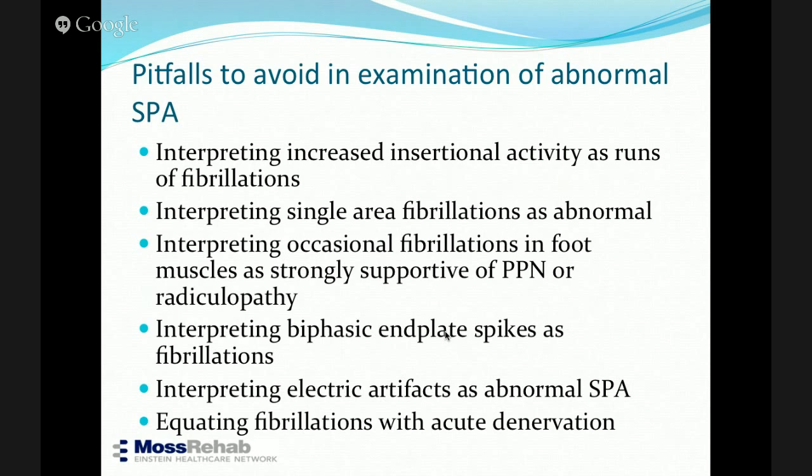Okay, so although they're similar looking, you would have some differences. So you have to be very careful in terms of difference. Because I've seen people, we saw fibrillations, and you guys show me, and I know fibrillations. So the only thing what they've seen is end plate spike. So you have to be careful in terms of interpreting something which is normal as abnormal, right?